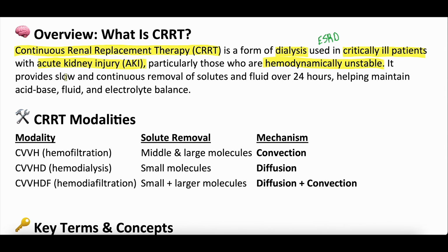What it does is it provides slow and continuous removal of solutes and fluid over a 24-hour period. It can run 24/7. This helps maintain all those things the kidneys do: acid-base status, fluid status, electrolyte balance, all that good stuff, all those critical functions of the kidneys.